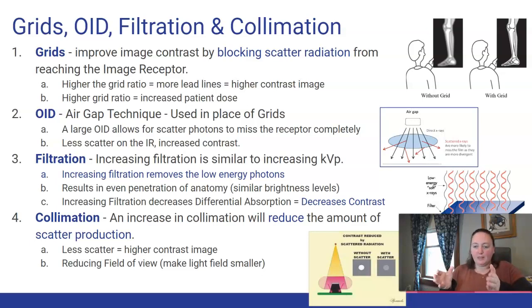It makes that beam, or that average energy of the beam, increased, right? So I always remember that when I increase my kVp, I increase my energy, I decrease my contrast. It's the same really for filtration, so if you can put those two together. So increasing filtration actually decreases your contrast.